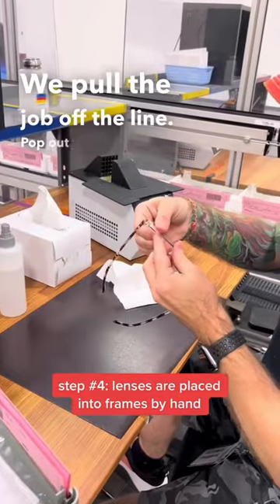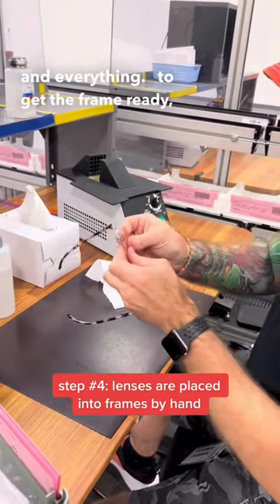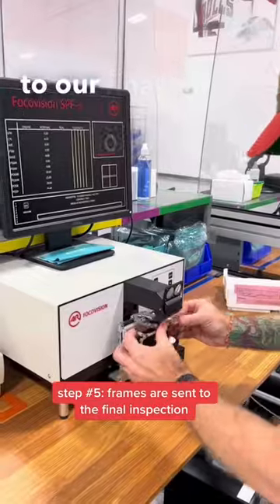We'll pull the job off the line, pop out the demo lenses and everything to get the frame ready. So once we're done with mounting the job, it sends it down to our final inspection process.